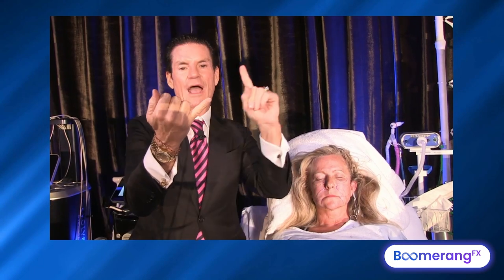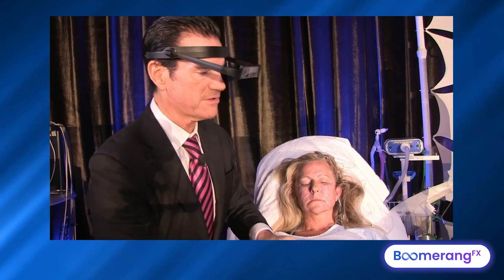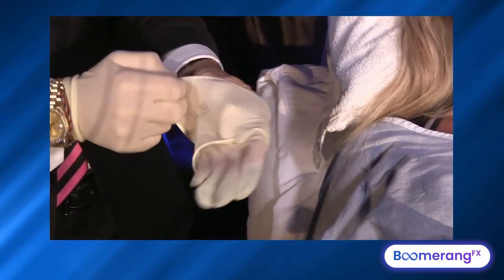Hello, Dr. Mulholland from Beverly Hills, California. We're going to do an injectable facial shaping treatment on our patient today. We're going to show Accutite, FaceTite, and the Morpheus to tighten and lift rather than volumize. Then, after heat, we'll add toxin for a Botox brow lift, Botox mid-face lift, and then do injection volumization and finish with suspension — all in one integrated conceptual elemental treatment. I'm going to put on a pair of gloves and show you how I marked out our patient Lisa today, which will compare with the photos I showed.